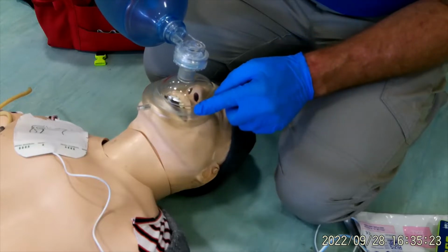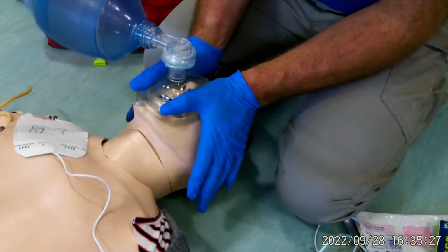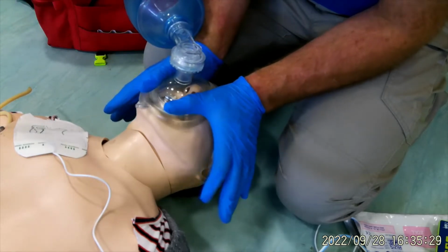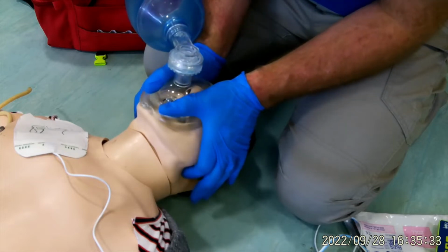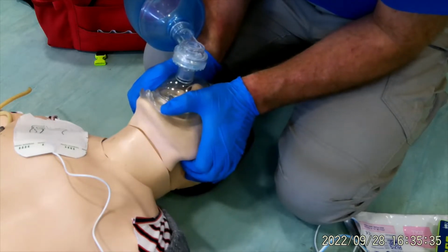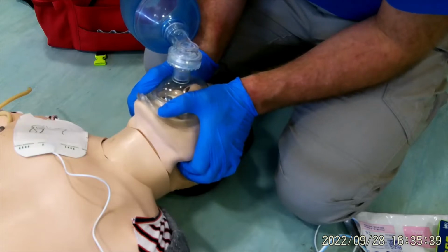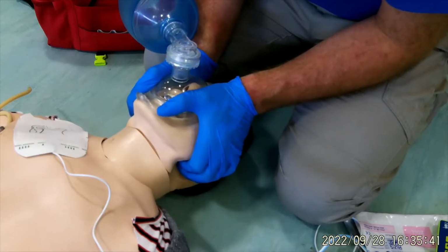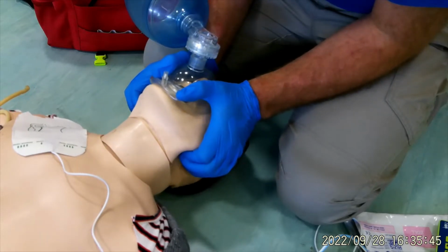Now we've got it in place, I'm going to hold it on with 2 hands, so my thumbs come down the mask. My index fingers then come all the way to the jaw thrust position, and I pull the jaw into the mask. If I thought there was any trauma, I would only want to do this, but if this was medical, I could also add some head tilt to it as well.